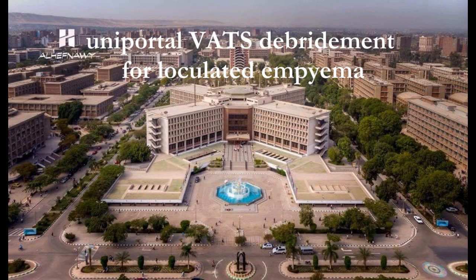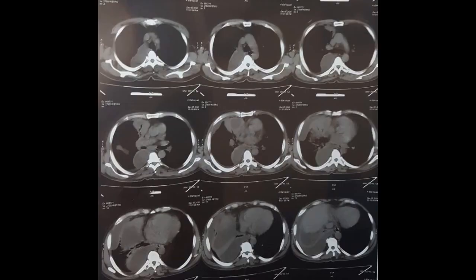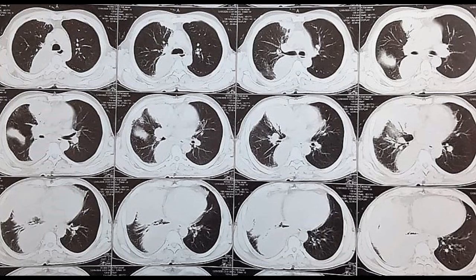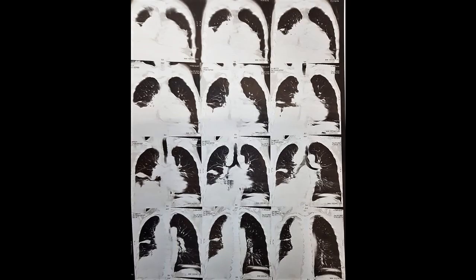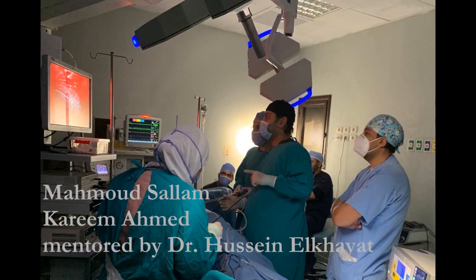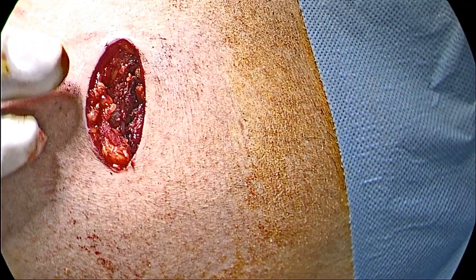We present a case of a 62-year-old man presenting with dry cough and fever for one month. His CT shows a loculated empyema.